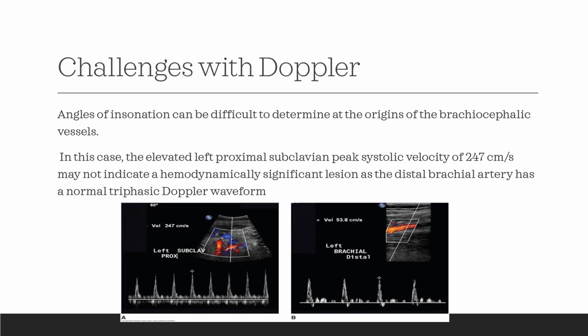So really when we're looking at our brachiocephalic and our subclavian, we're evaluating more of the triphasic appearance of that vessel than the peak systolic velocity.